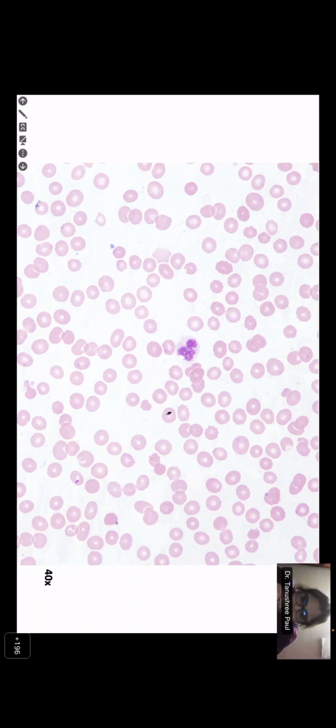Okay, so platelets is better not to comment because this is actually a finger prick smear, where the platelets might be pseudo low at times. Your findings are mostly correct. I believe that the size variation among RBCs is there, but it's mild. Probably some smaller and maybe some larger. Most of these are normocytic. Probably most of these are also normochromic. You see a central pallor, which in most of these occupies about a third of the RBC. There are some poikilocytes, mostly crenated forms. I don't know whether it's a true bite cell or not, but yes, there are some poikilocytes there.